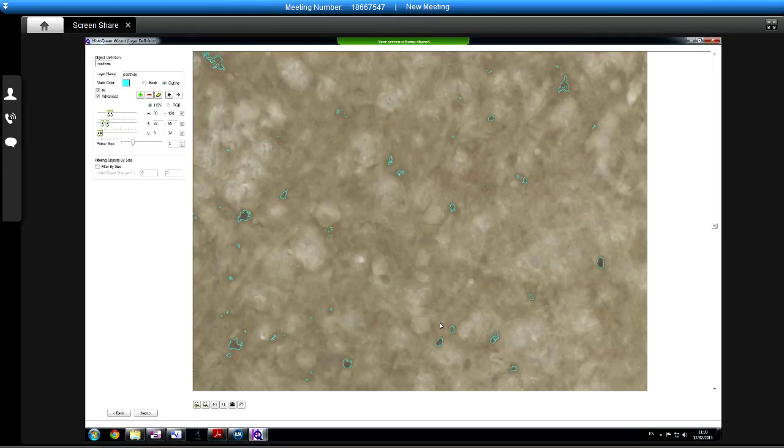So that's yes, isn't it? Yes, yes, yes, yes. Is that positive? Just out of focus a bit, maybe? Yeah. Is that positive just out of focus a bit? Sure, you can't tell with that really.